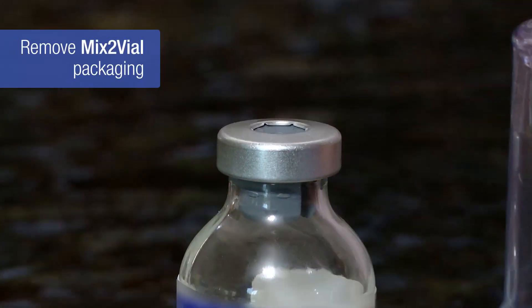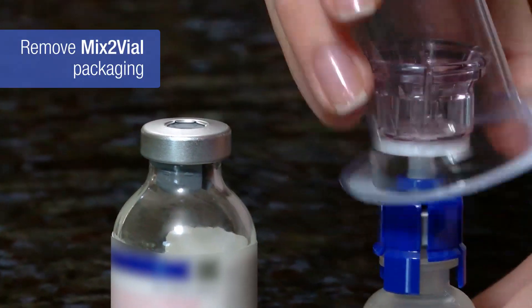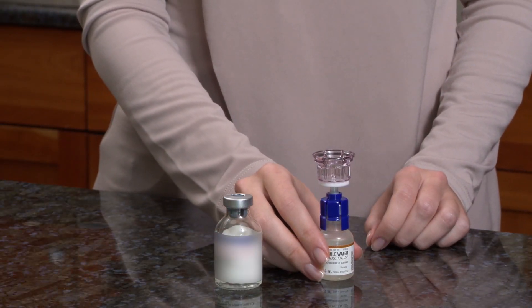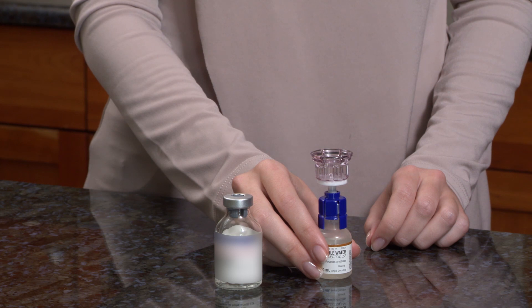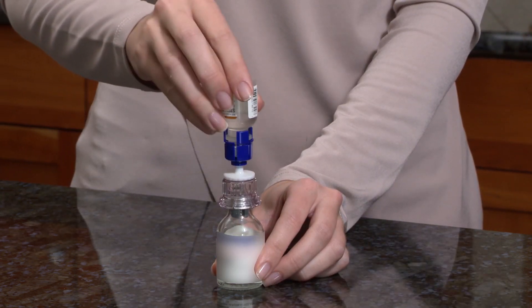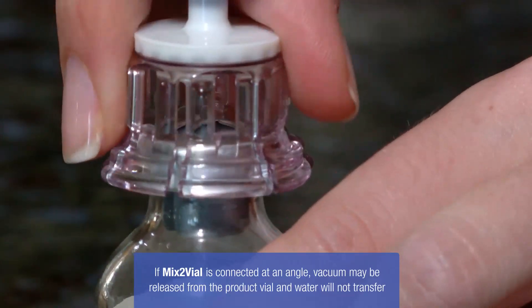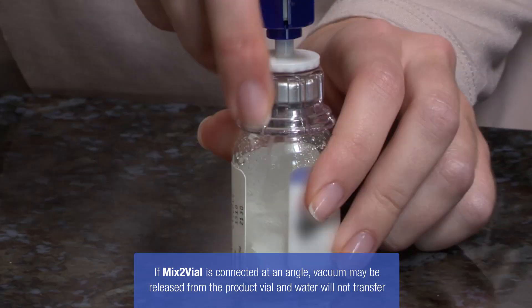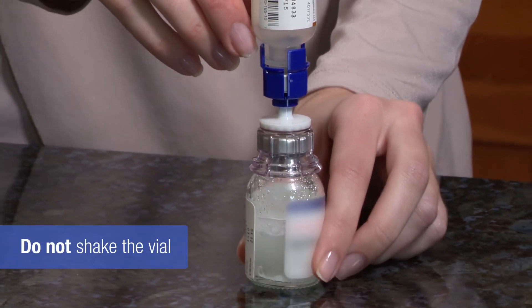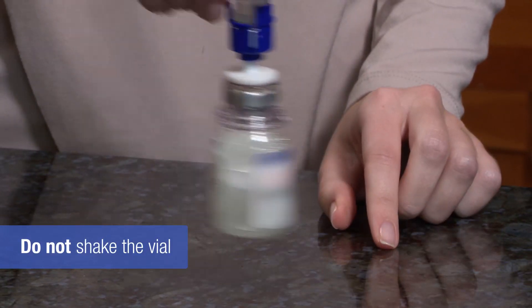Carefully remove the mix-to-vial packaging and discard. With the product vial on a firm flat surface, hold the water vial upside down with the mix-to-vial device attached and push the clear end of the mix-to-vial down through the product vial stopper. The water should flow into the product vial automatically. Gently swirl the product vial until the product is fully dissolved.